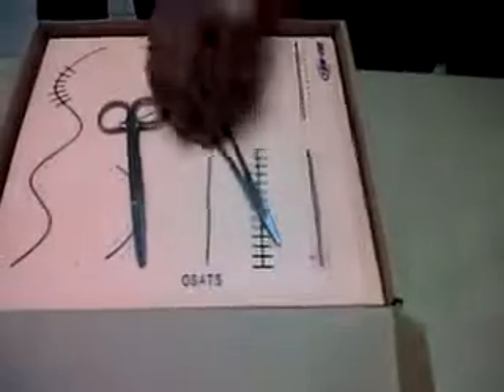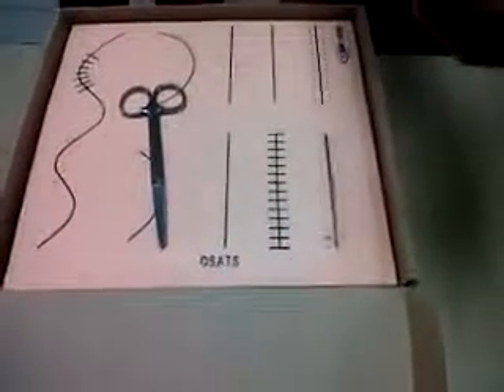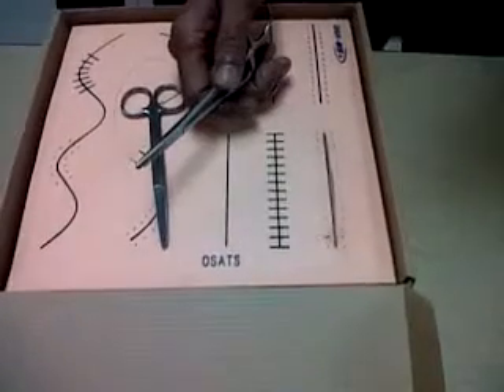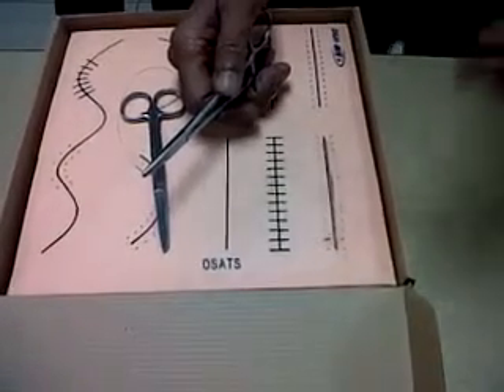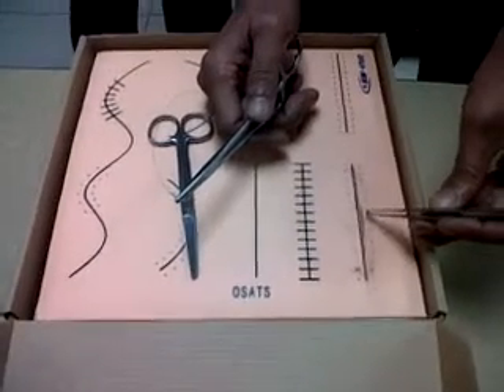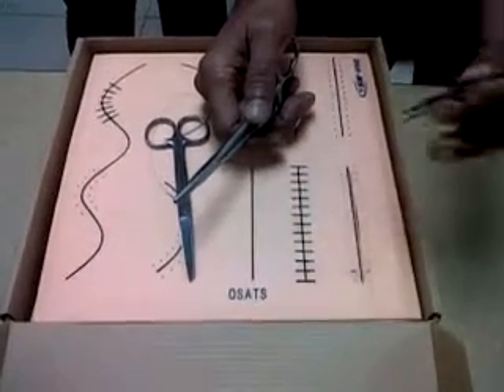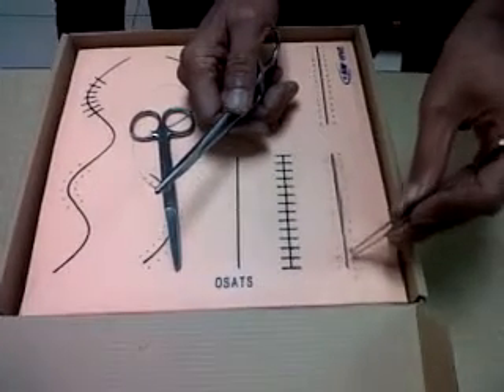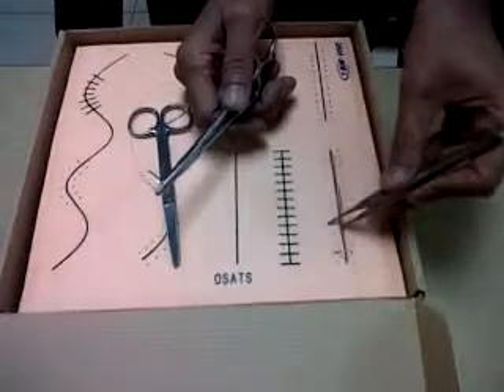The third variety is the horizontal mattress. When do we do the horizontal mattress? When we want speed and when there is too much profuse bleeding coming from the edges which cannot be controlled — and we can sacrifice cosmetic beauty in exchange for speed and control of bleeding.